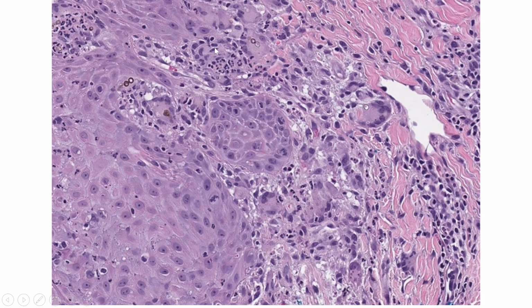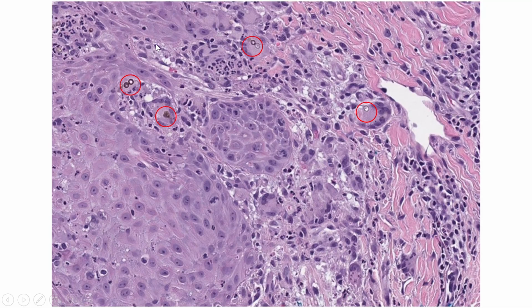When you see neutrophilic collections along with a granulomatous proliferation, you should always think of a fungal infection. In this field, some of you have been able to make out the fungus. Some of you must have thought it is artifactual. These rounded or spherical bodies which have a brownish tinge were the fungi in this particular image. You can see some of these organisms within the multinucleated Langhans type giant cells as well. The circles in red represent the fungal bodies.